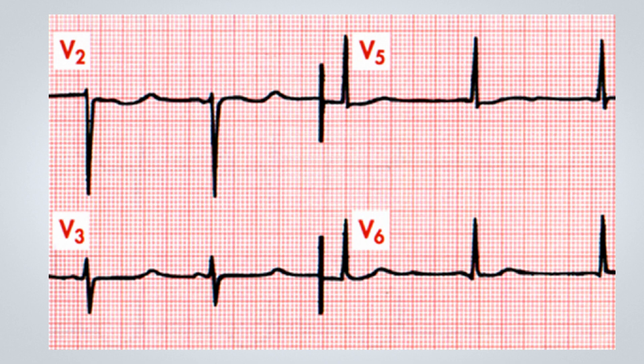You should pause the video to review the tracings before we discuss. In this ECG, we only have some precordial leads, namely V2, V3, V5, and V6. At first glance, there appears to be a sinus rhythm with each QRS complex present. The PR interval seems normal and I cannot identify any notable changes related to the QRS complex itself. When we observe the ventricular repolarization, we can see that the QT interval — which spans from the start of the QRS complex to the end of the T wave — is substantially prolonged. If we were to measure this interval, we have about 18 millimeters, which would equate to 720 milliseconds or 0.72 seconds.